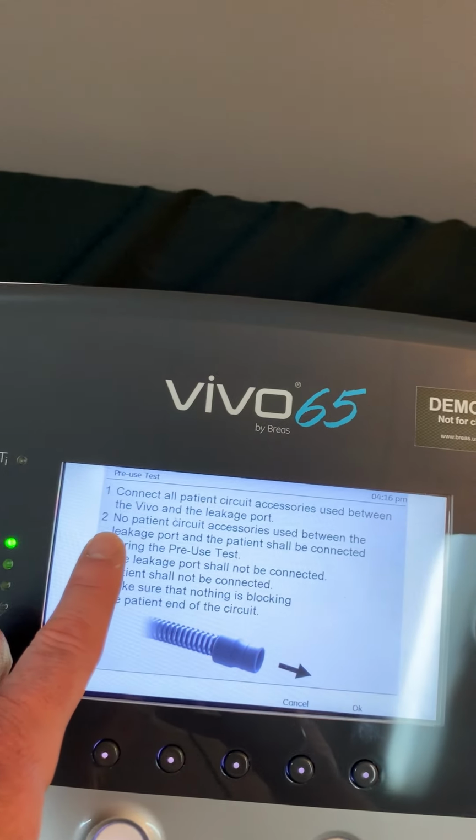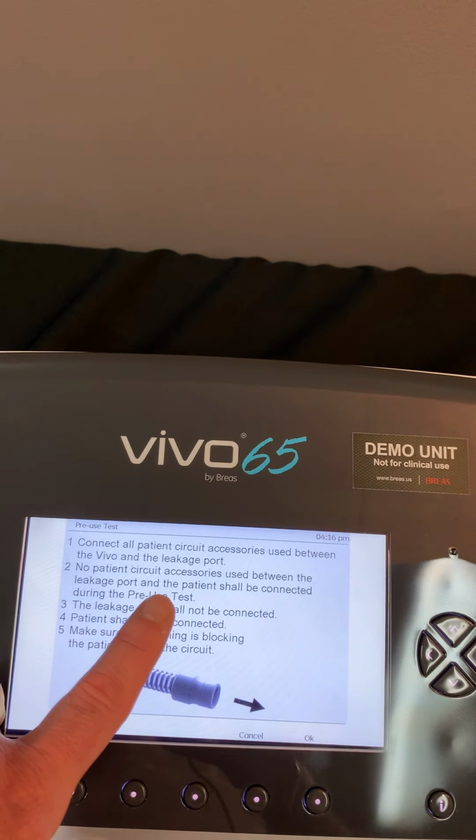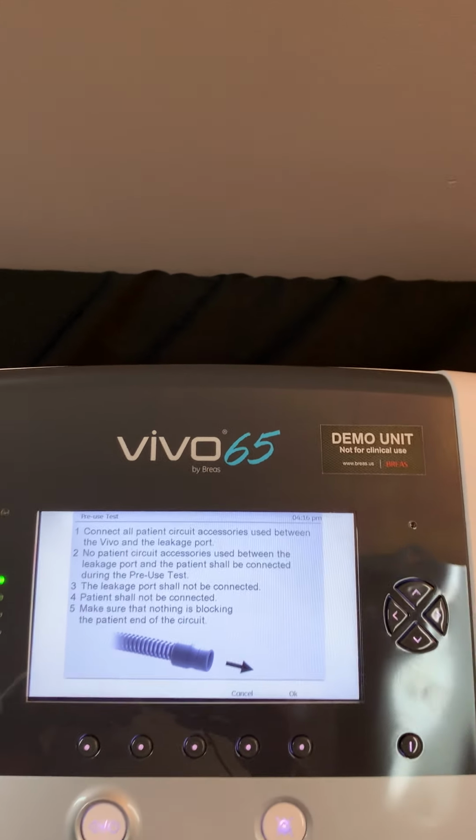Okay, number two, no patient circuit accessories used between the leakage port and the patient shall be connected during the pre-use test.